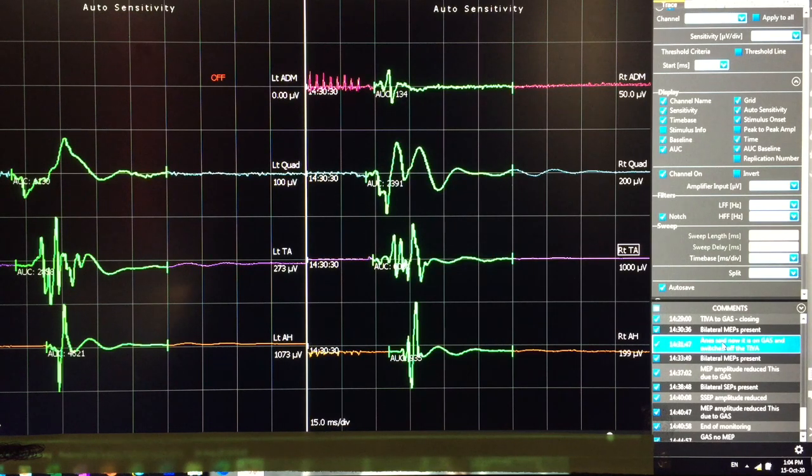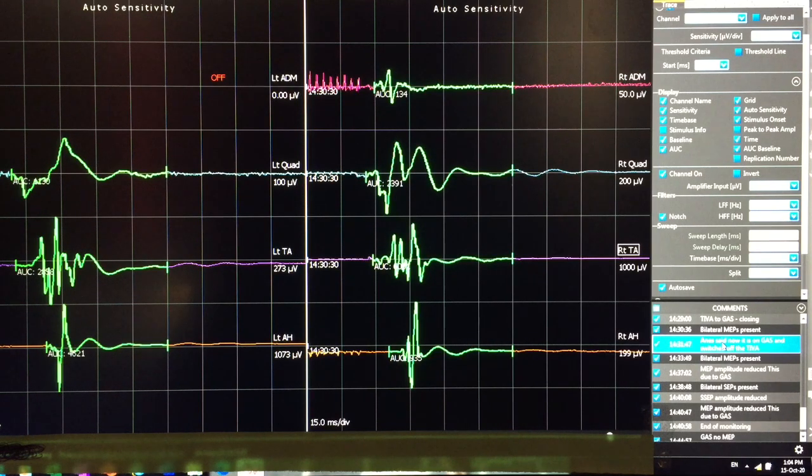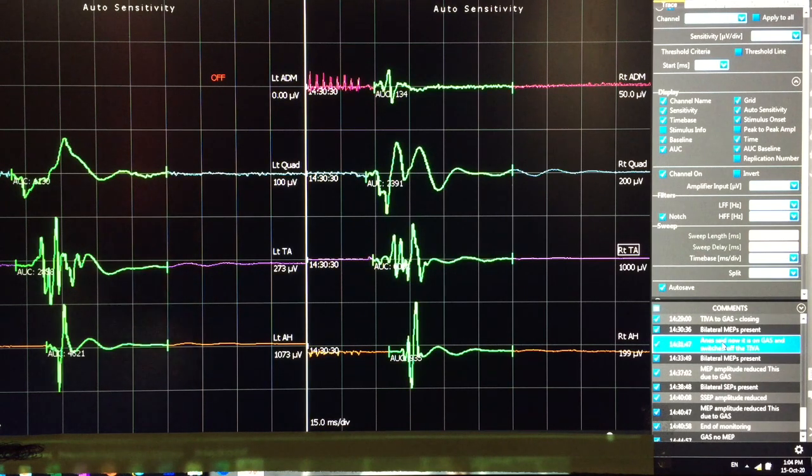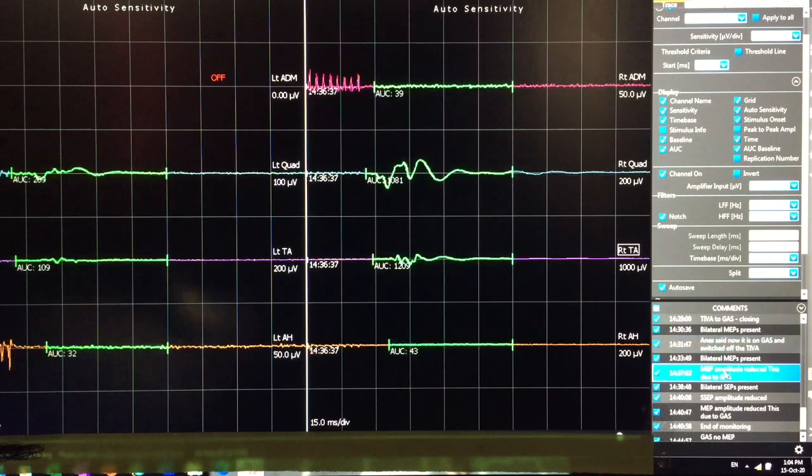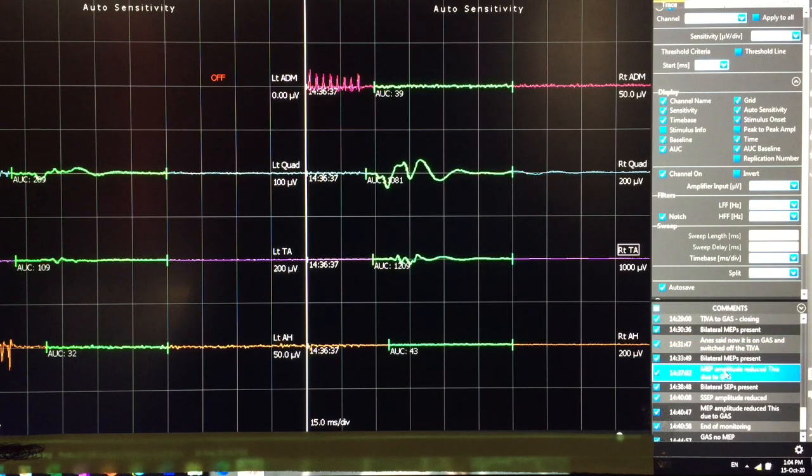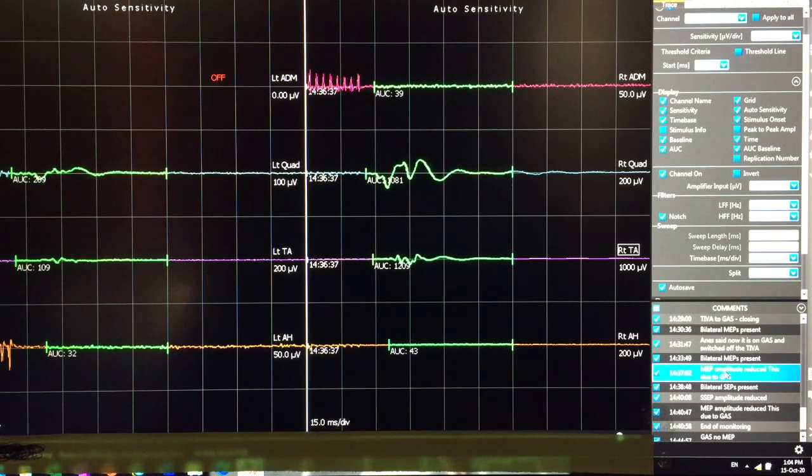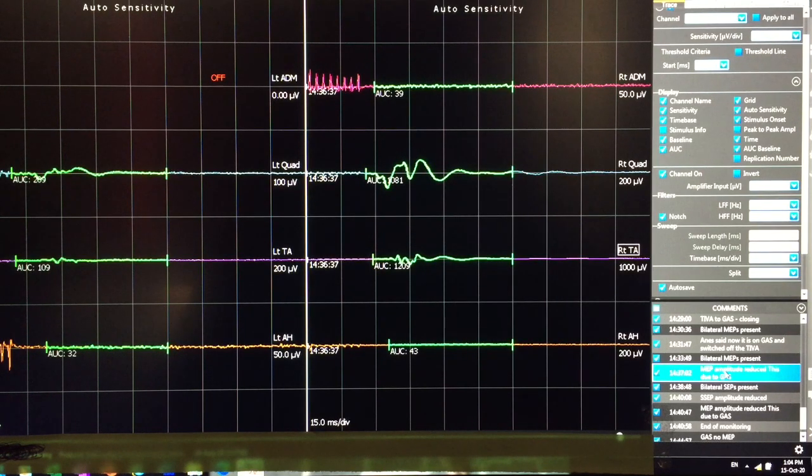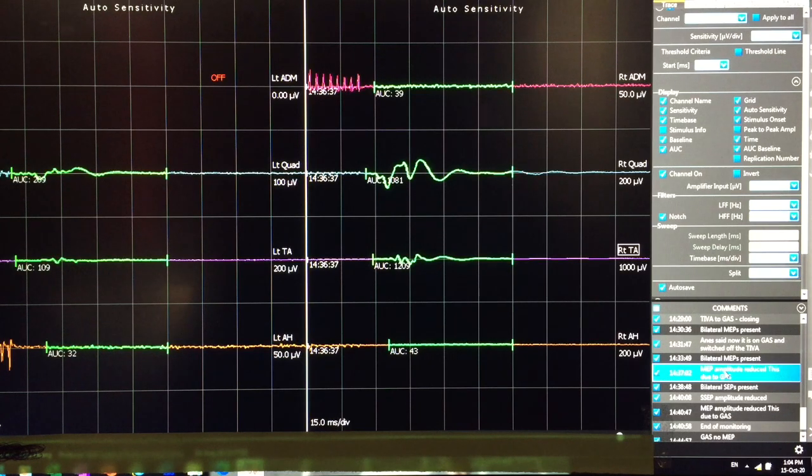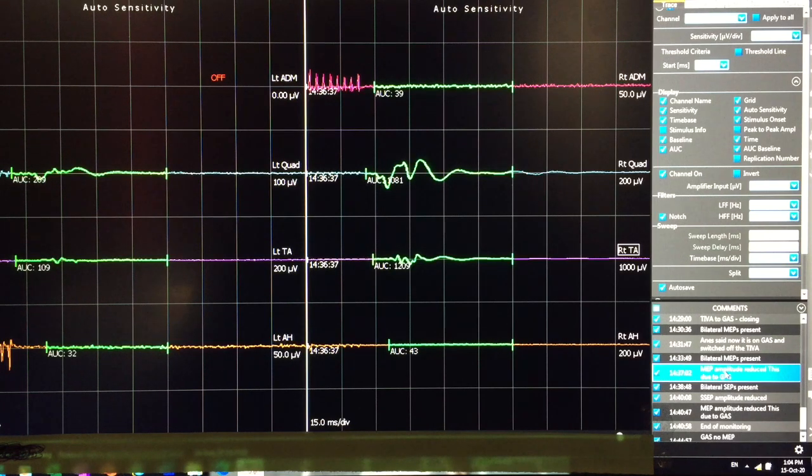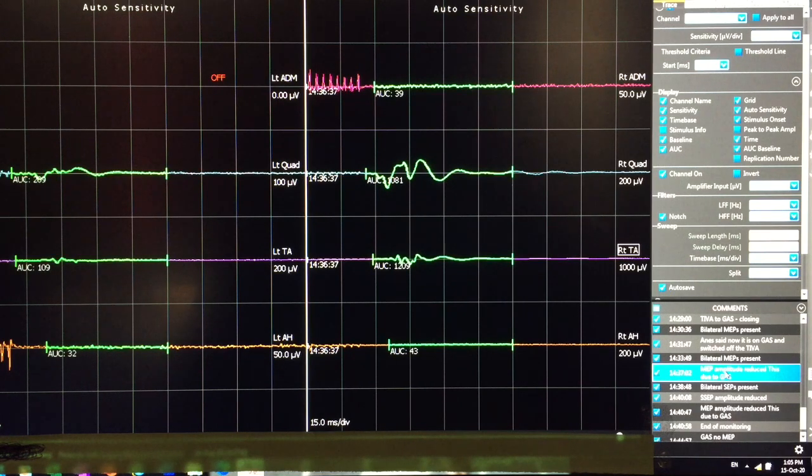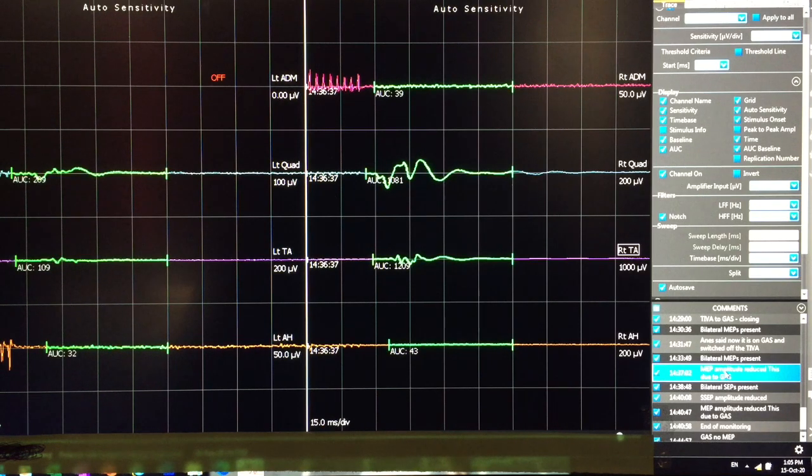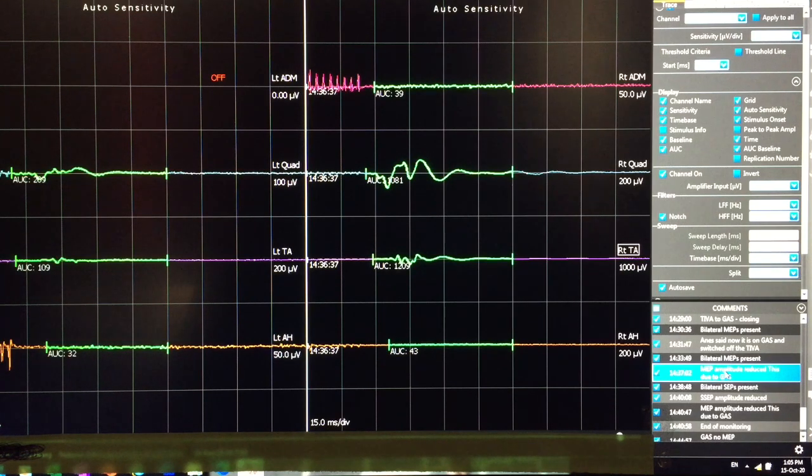So I recorded the second MEP at around 1437. That is approximately five minutes after we switched off the TIVA and put the patient on the gas. So here you can see MEP is not that good or the MEP amplitude is affected in almost all the channels apart from a few channels. Still you can see some MEP responses, but it is very low in MEP amplitude.